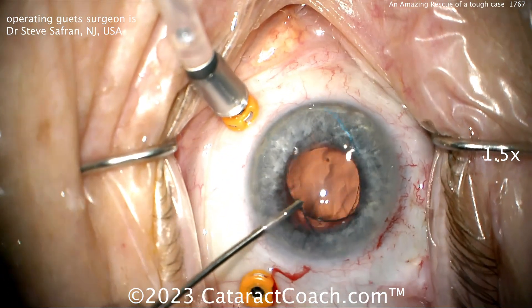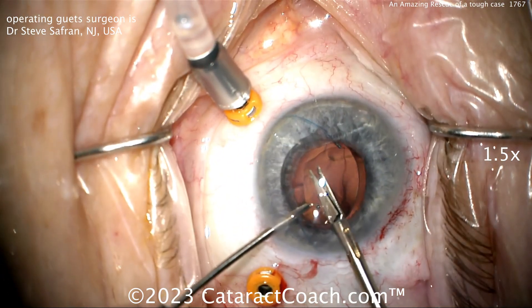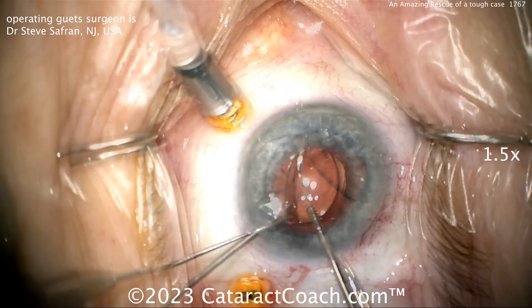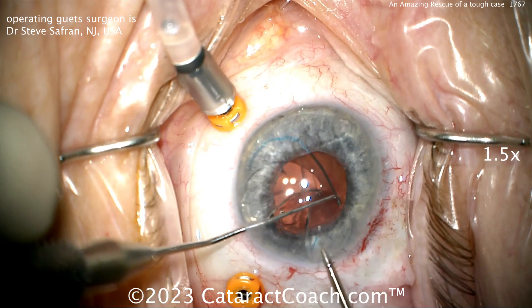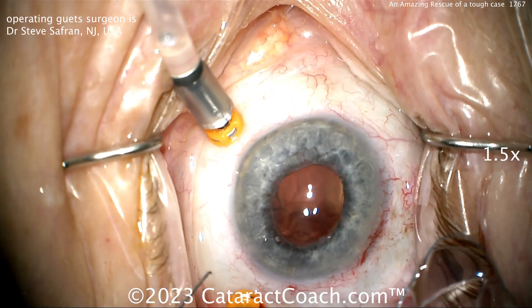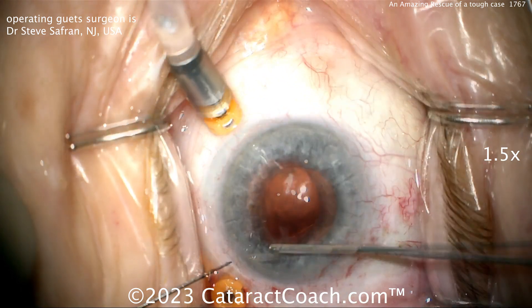Now it's time for a new lens. This old lens is going to be cut up and taken outside the eye — that looks like a three-piece acrylic lens. Notice how he doesn't cut all the way through; he cuts about 90% through the optic. When he pulls out one half, the other half kind of follows. Brilliant.